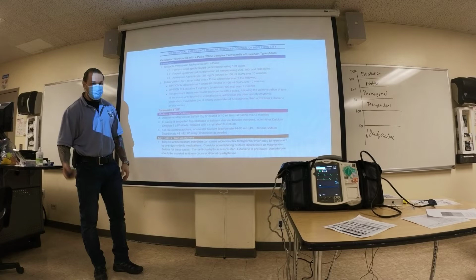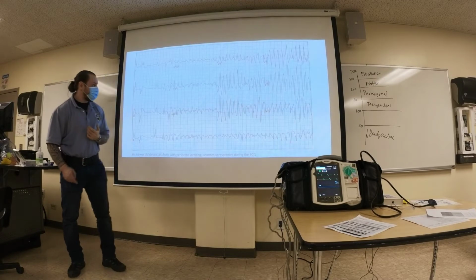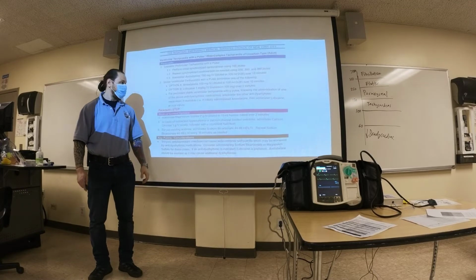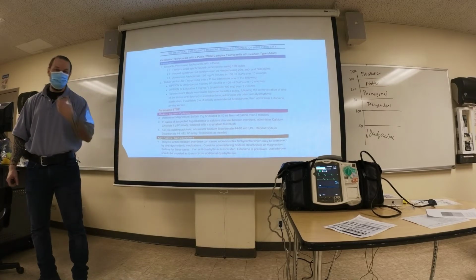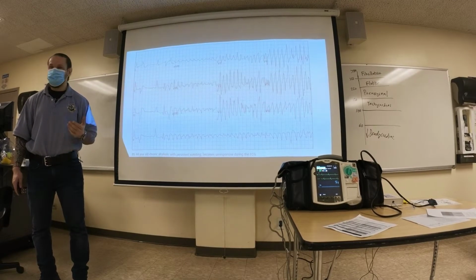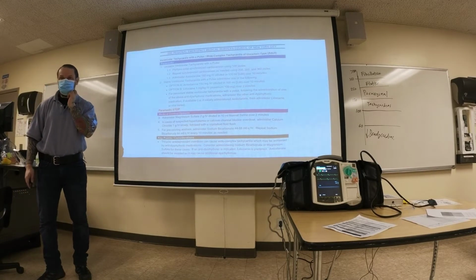Then we have our New York City REMAC protocols. Let me ask you this question. You have a guy who presented with this paroxysmal rhythm. You weren't sure, you did a 12 lead, and you think it's torsades. You open up your protocol to give him treatments. First, you have to determine if he's stable or unstable. Let's say he's alert and oriented times 3, blood pressure 120/80, respiratory rate 20, saturation 95. So stable or unstable? Stable. Okay. What are we going to do?